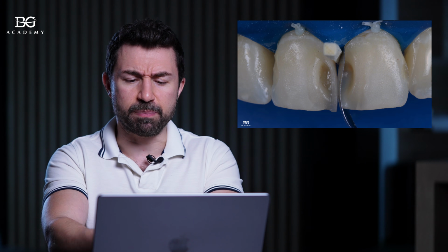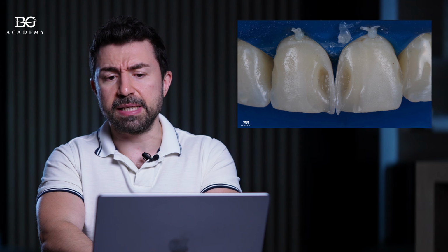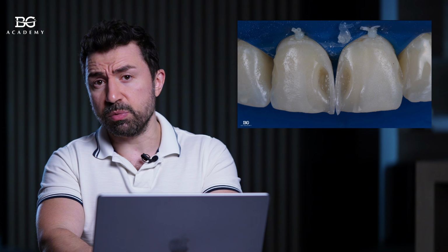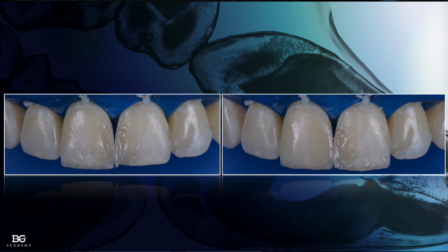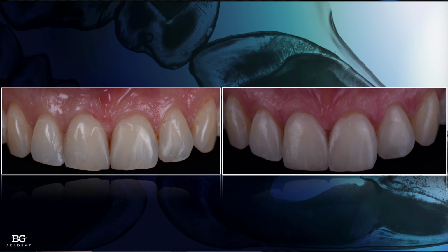With the same technique, composite will be placed here, polymerized, and now you can see the profiling of both central incisors. The rest will be done with the dentin shades, with some tints, stains or whatever, and this is how it looks once we have dentin restored. And this is the process of restoration using some enamel and stains and tints, and this is before and after.